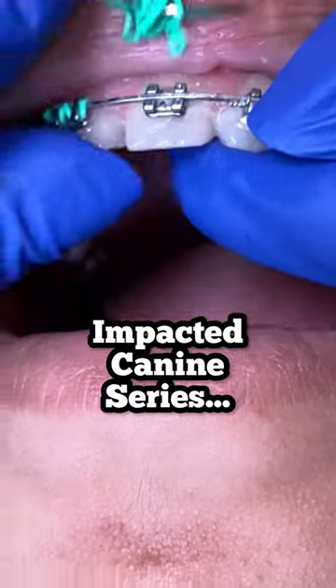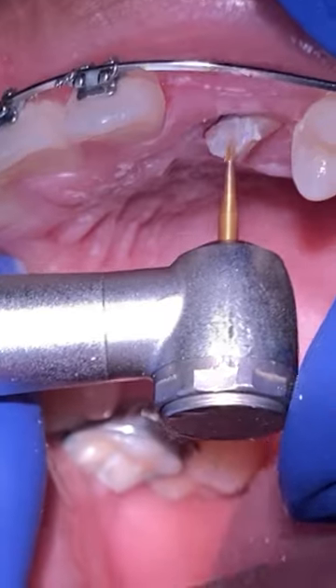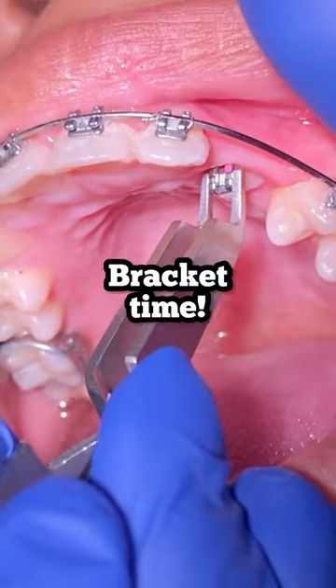Hey everyone, this is Abby, your hygienist here at Two Time Family Dentistry. Today's video is pretty cool — we're going to show you a patient that we've been showing you in the past. She had an impacted upper left canine tooth, and today there's enough exposure on the tooth so we're able to place a bracket on there.